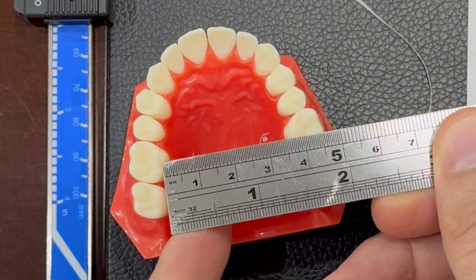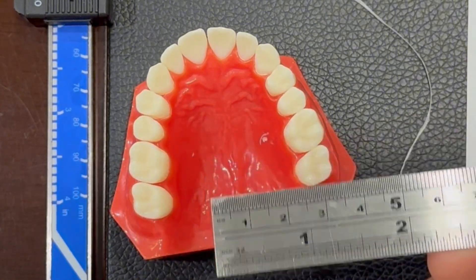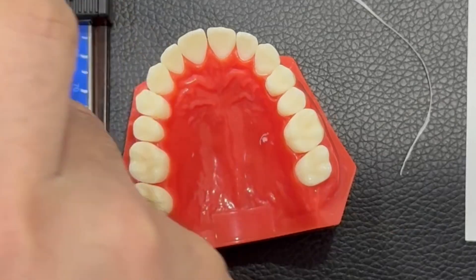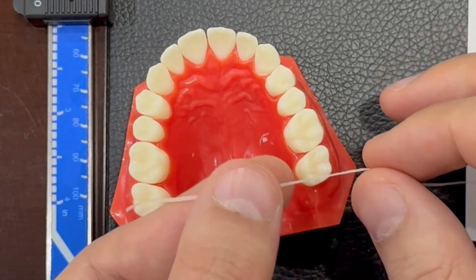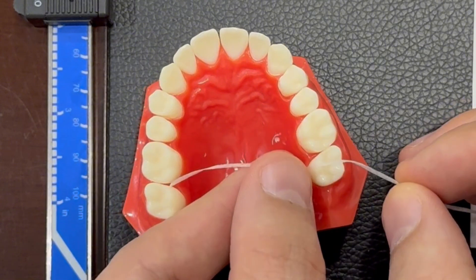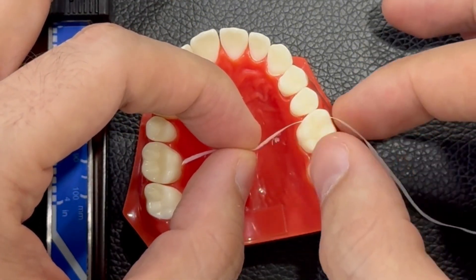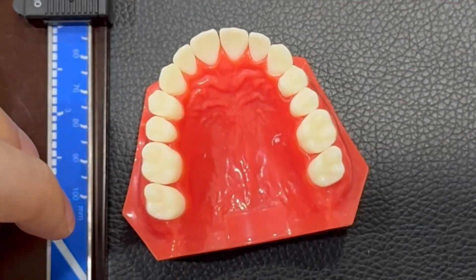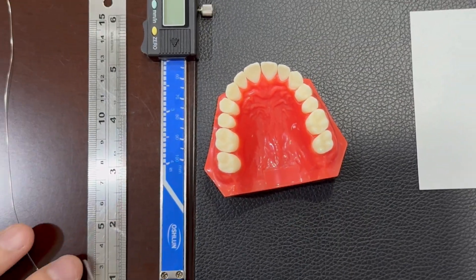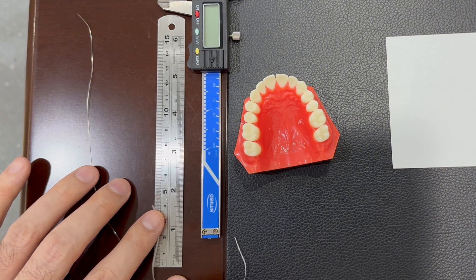It's not easy to place the ruler inside the patient's mouth, so we have different ideas. Either use dental floss with the help of someone, or measure with a tweezer — just take it like this and measure to this point, then place it on the ruler again to find the right width of the maxilla.